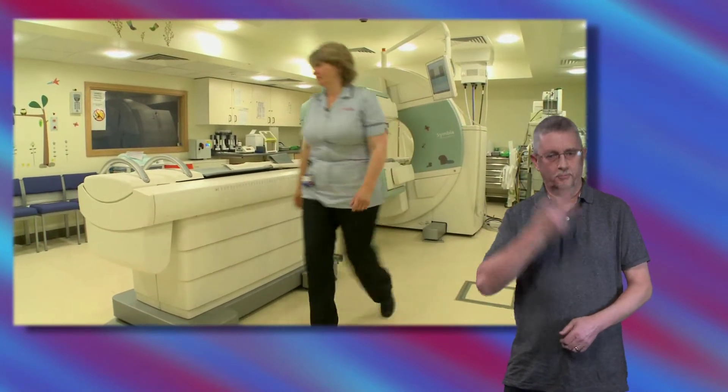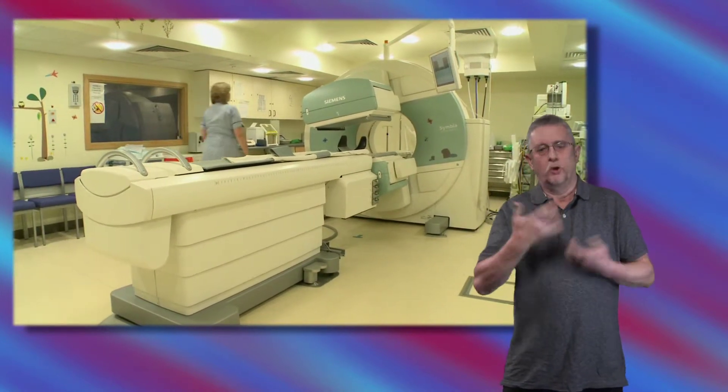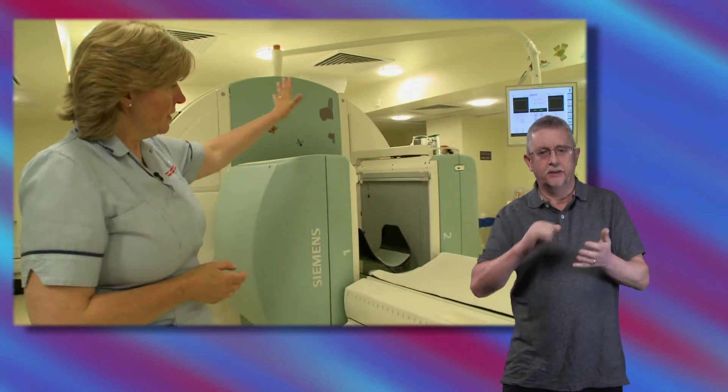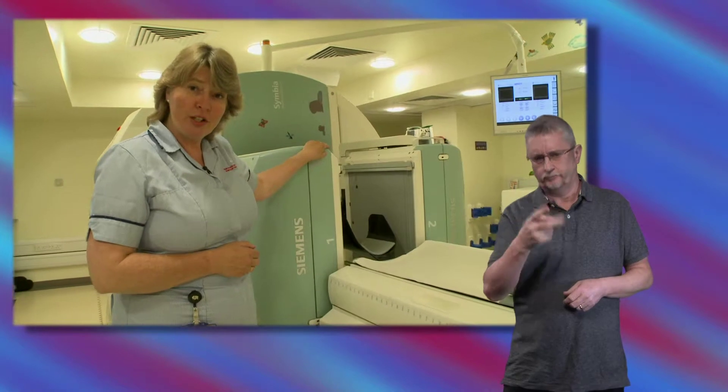Hello, my name's Pippa and I'm a radiographer. I'm going to show you how I would do a SPECT brain scan. This here is my camera. It consists of two gamma cameras that will be able to take your pictures.